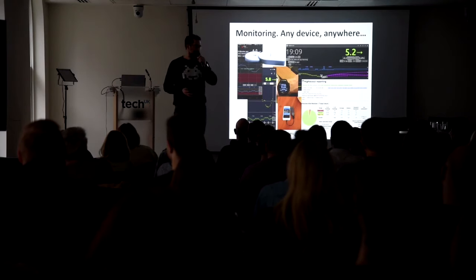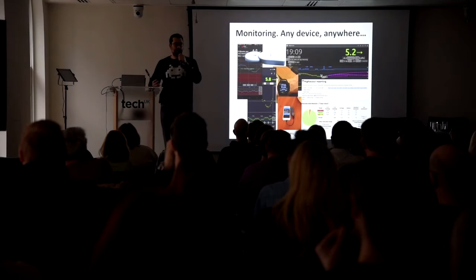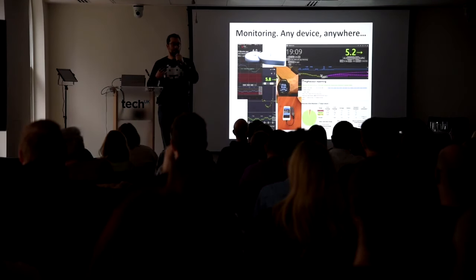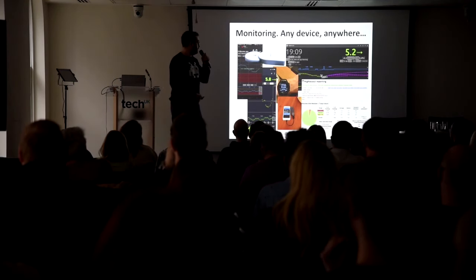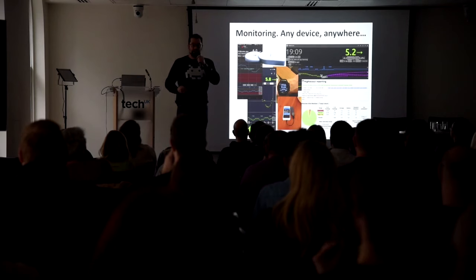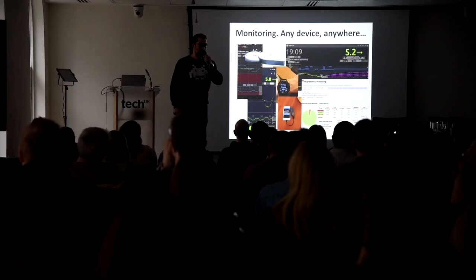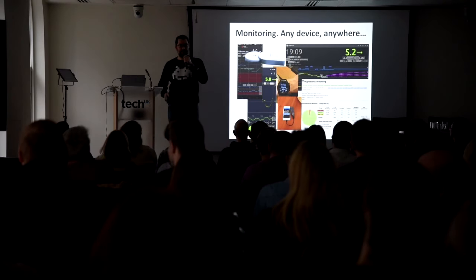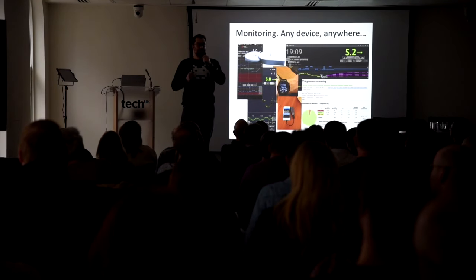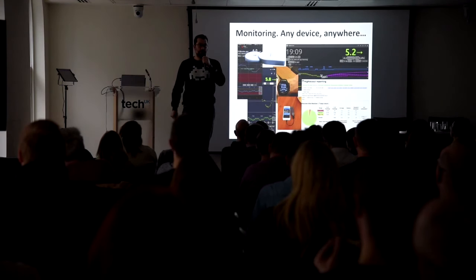That's great as well. We've got Nightscout, the granddaddy of all of this stuff, which allows the data to be shared in an interoperable format so that you can use it with other systems. That's an important point in all of this. Visibility on a watch, so actually you can check your blood glucose wherever you like. And of course, things like this, which allow anybody using a Medtronic device to have their data uploaded into something usable as a shared data source, so that you no longer have to pull your pump out to look at it. You can actually do it on a watch whilst you're wandering around.